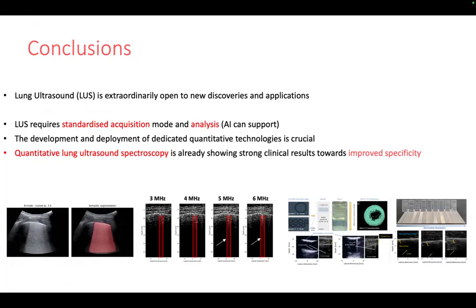But the future to me lays in the development and deployment of dedicated quantitative technologies that, as shown already by quantitative lung ultrasound spectroscopy, can improve specificity and therefore really allow, for example, diagnosis potentials for lung ultrasound.